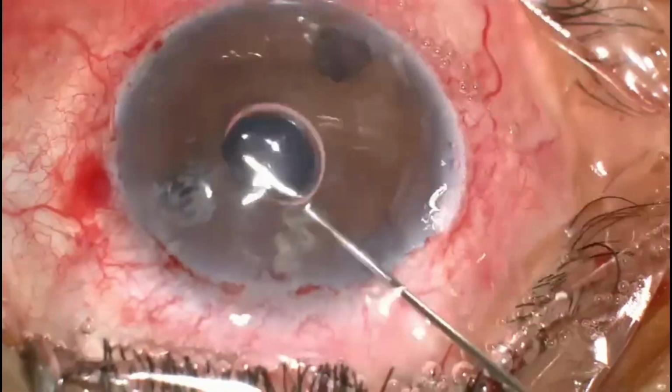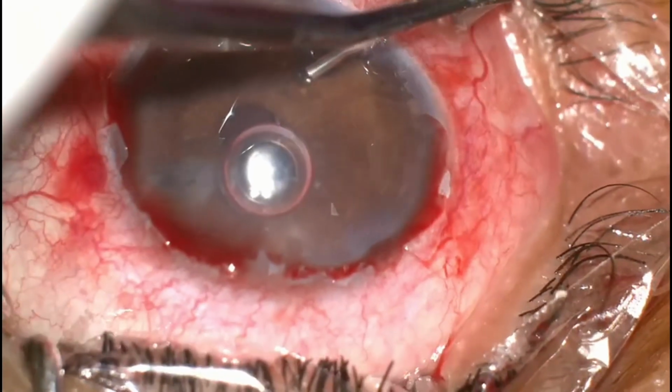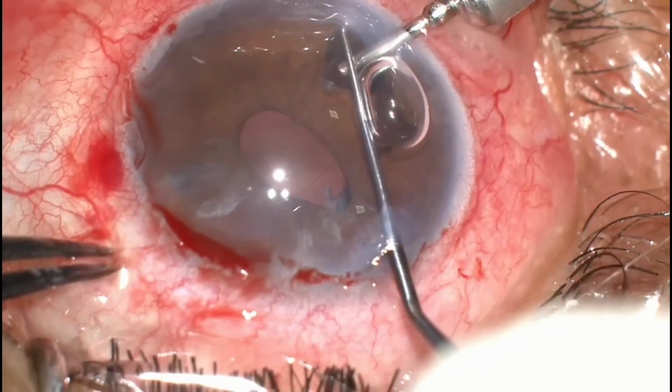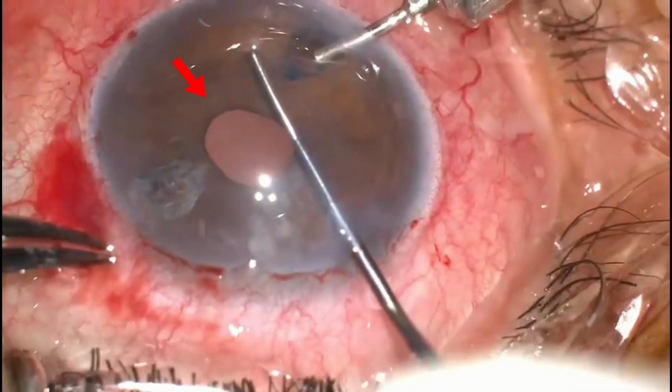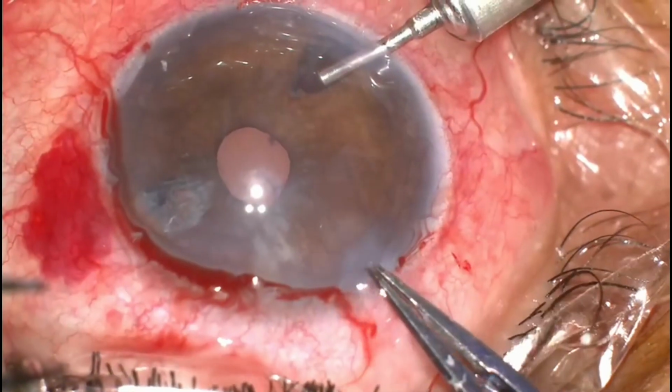And so every time I try to go in with an AC maintainer and try to put in air, the same thing repeats itself. The air keeps escaping. So I shift to saline and I start doing my descemetorhexis under saline. So you can see the DM scoring happening over there under saline.